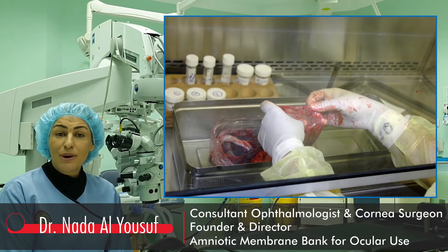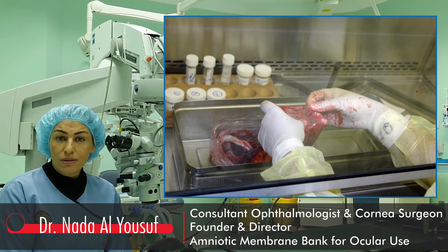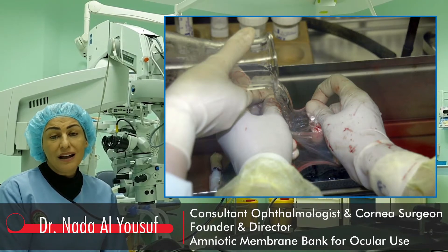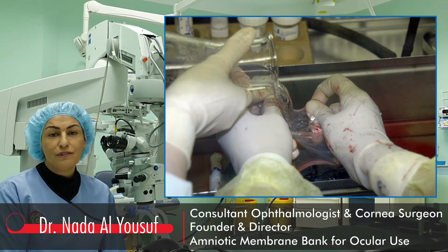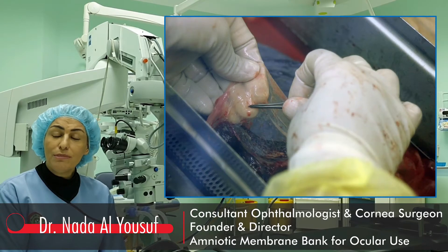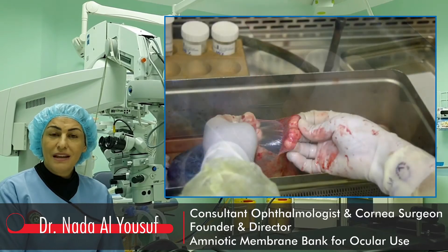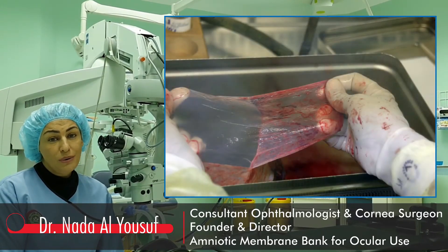The amniotic membrane is pulled away from the chorion by blunt dissection and washed with DMSO at concentrations of 4%, 8%, and 10% for 5 minutes each. Blood clots are removed from the amniotic membrane using non-toothed forceps. The amnion is separated from the chorion slowly and gently.